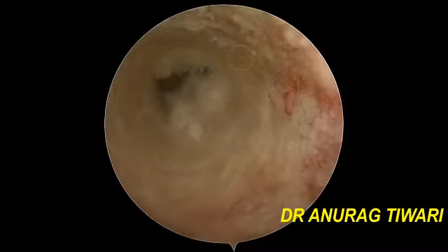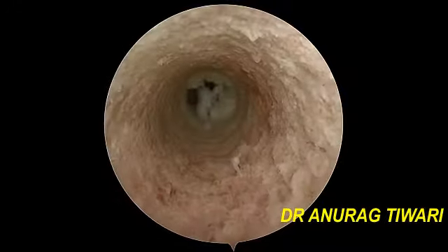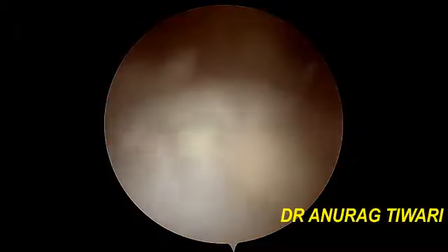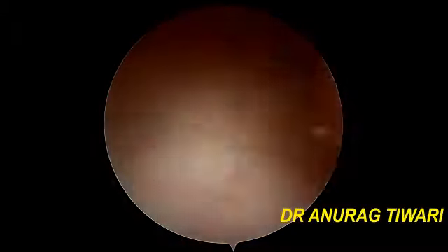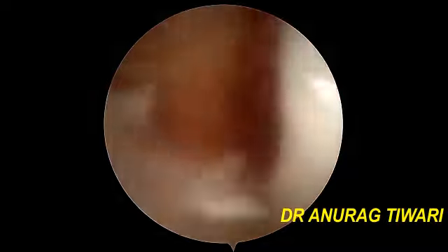This is through the tibial tunnel, the visualization. This is known as tunneloscopy. So this confirms that there is no blowout of the tibial tunnel. The tibial walls are good enough. There is no blowout, there is no complication. Again back to the anterolateral portal.